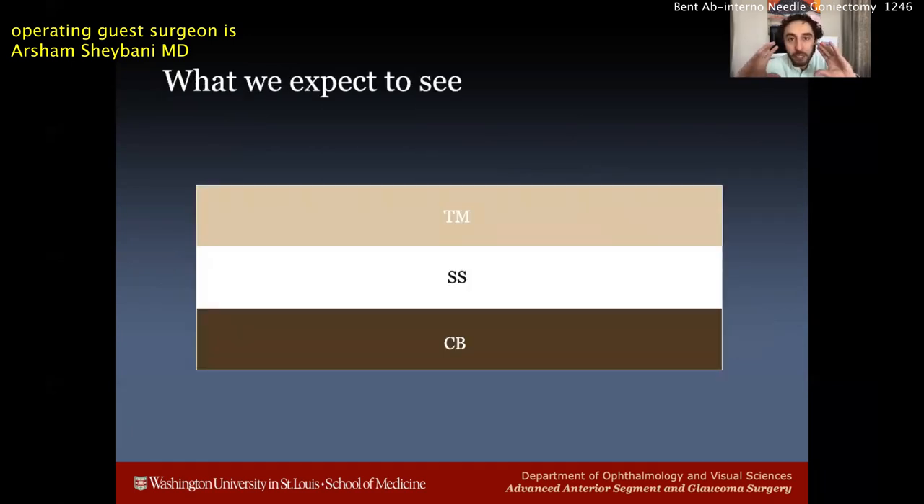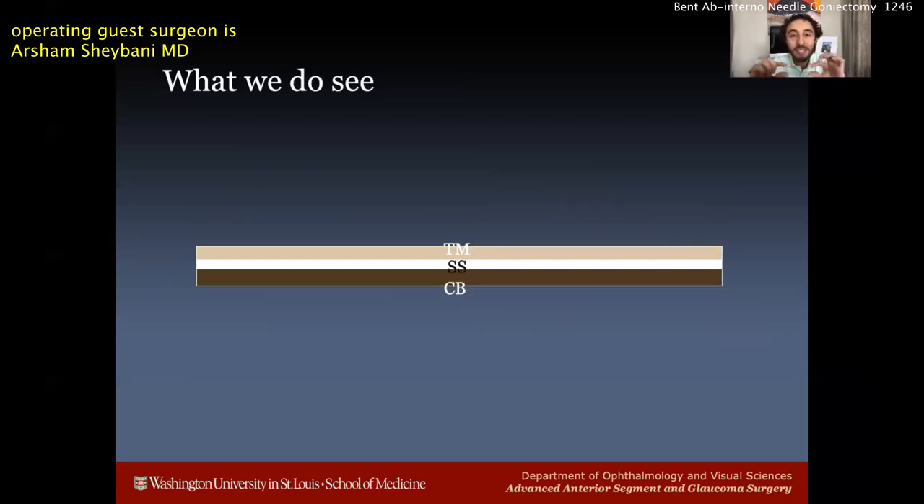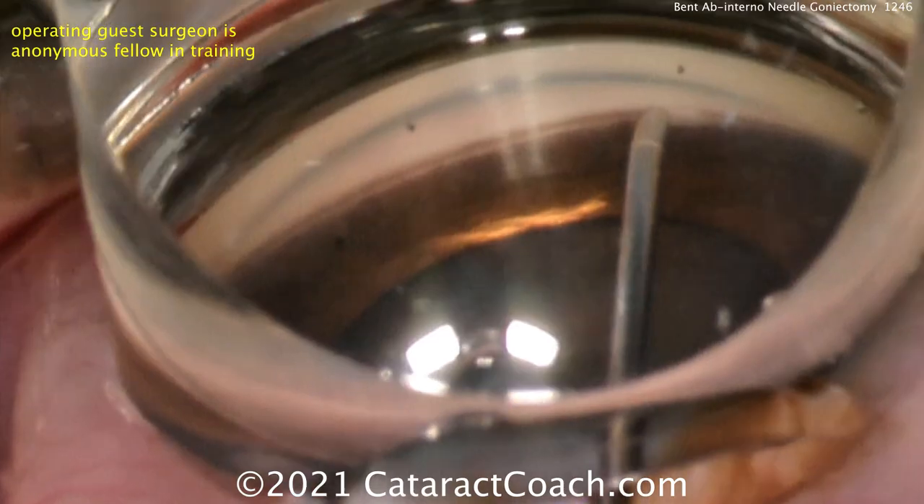In an extreme case, if the trabecular meshwork, scleral spur, and ciliary body band are perfectly in line, all you'll see is one single piece of tissue and you're not sure what you're viewing. Most of the time this is what things look like when your view is not that great. When you have the patient's eye properly turned away, you'll see the trabecular meshwork, the spur, and the ciliary body band in distinct layers. When it's not turned enough, the layers look shorter and blend together, making it very difficult to place your device correctly. If this is your view, turn the patient's head slightly further away to get a better viewing angle.